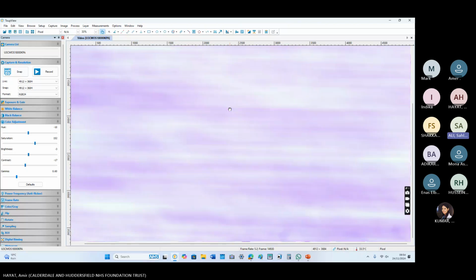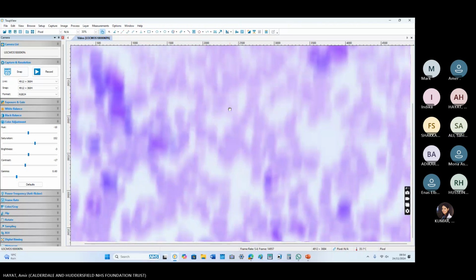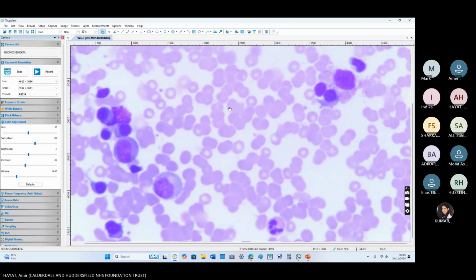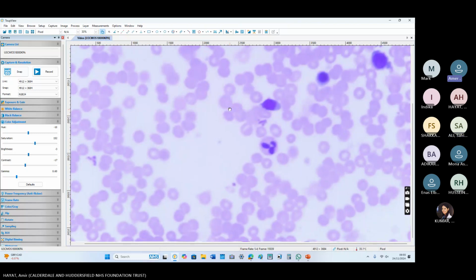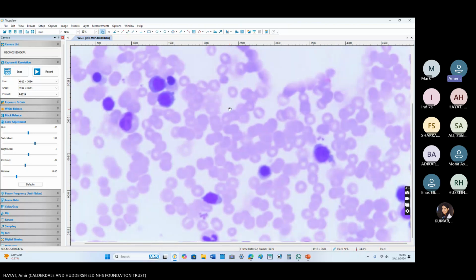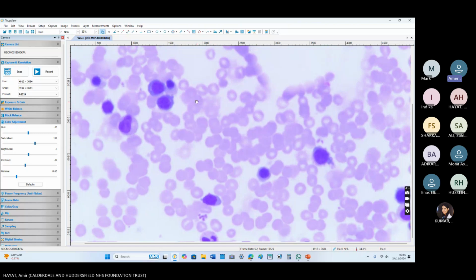Sorry, Amir, is the flame-shaped plasma cell typical for IgA? The flame shape is usually, which I have seen common in Waldenstrom, but the book has mentioned flame-shaped cells in IgA. But I have seen most of them in the Waldenstrom bone marrow, not in any other case. Like these are plasma cells, but this is not flame-shaped. Only these few projections here, but I will not call them a typical flame shape.